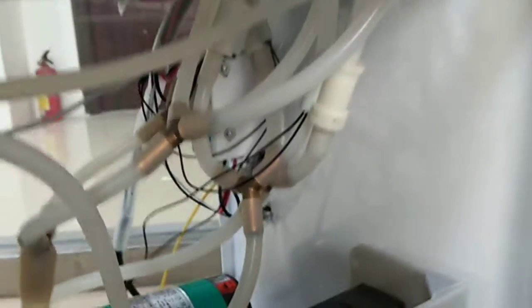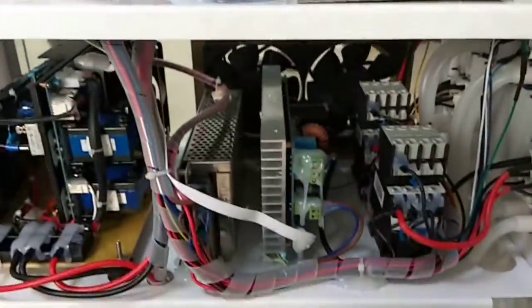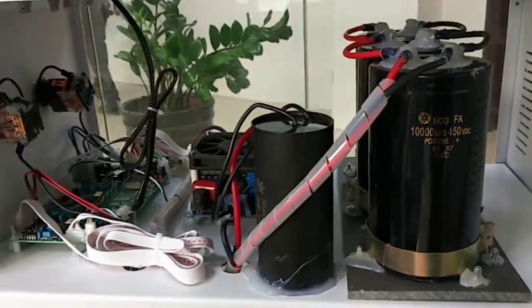Now, if we have a good look at the units, that's the overall unit inside, as you can see.